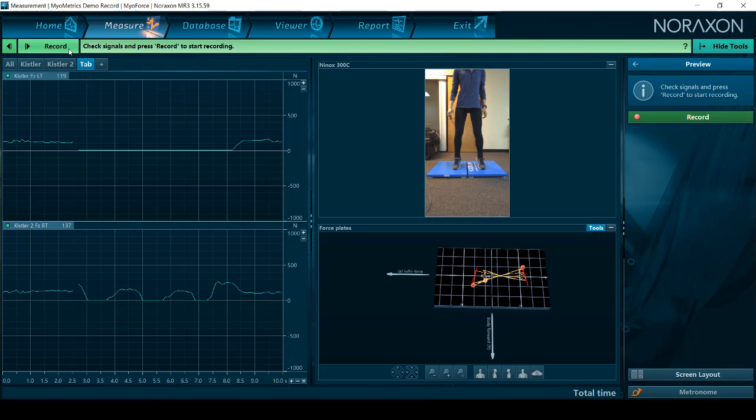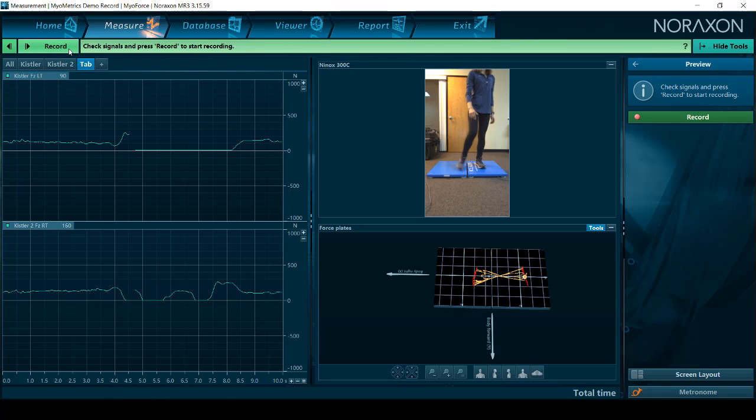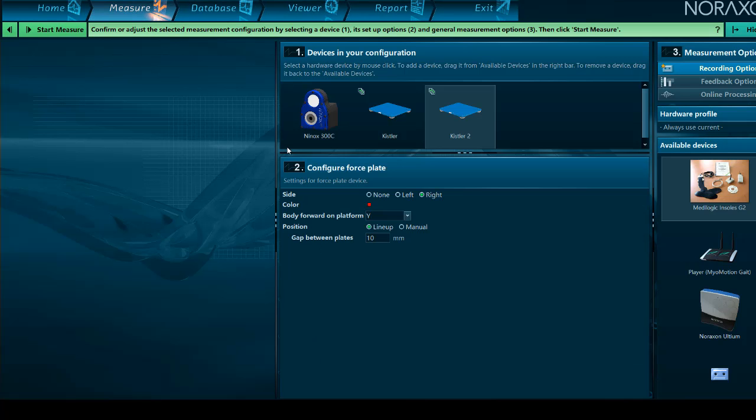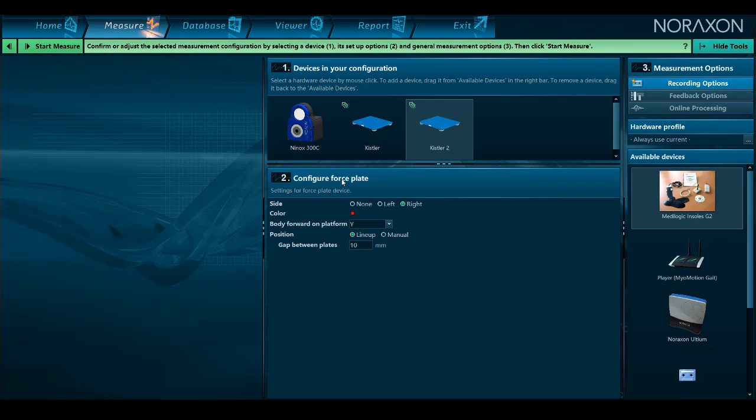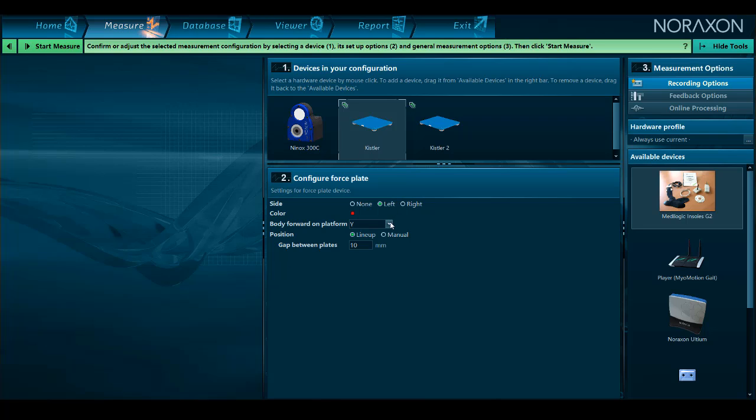We can confirm the opposite polarity on the left side by having the subject stand on the force plate and sway back and forth. Back in the configuration, we will change the left side y-axis positive to y-axis negative.